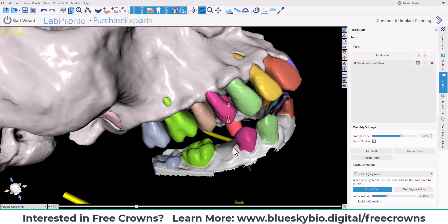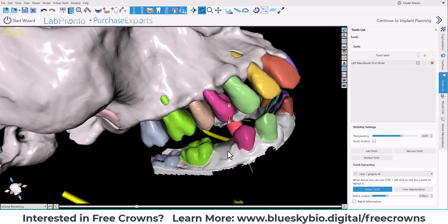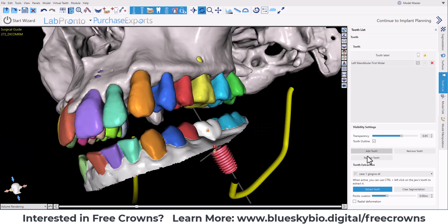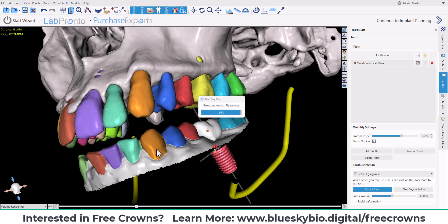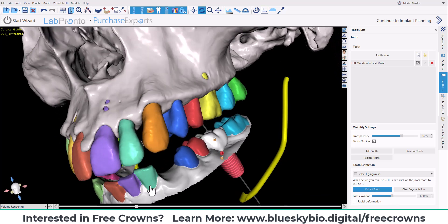We have additional options regarding pontic ovation and radial deformation here as well. To demonstrate, let's raise this a bit, then CTRL+click, and we can see the results.